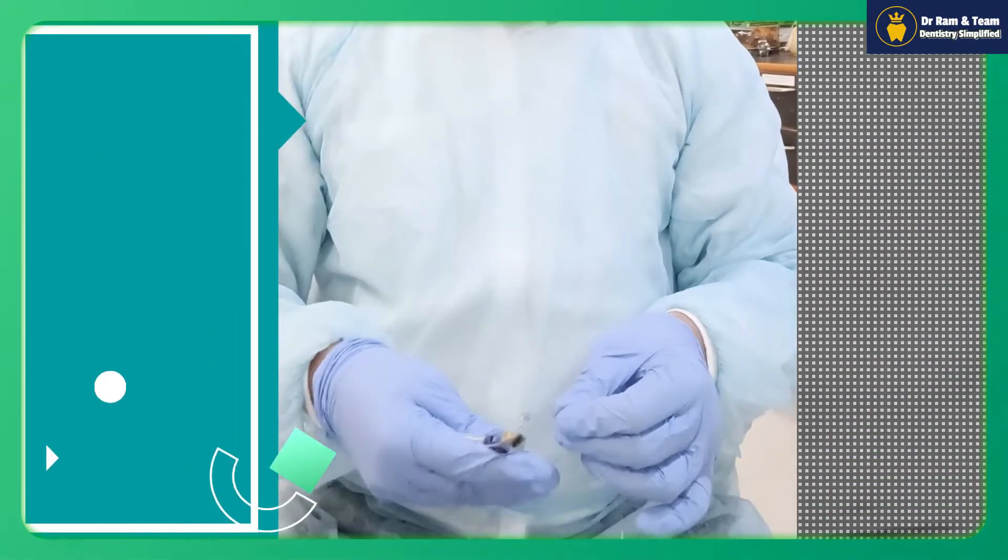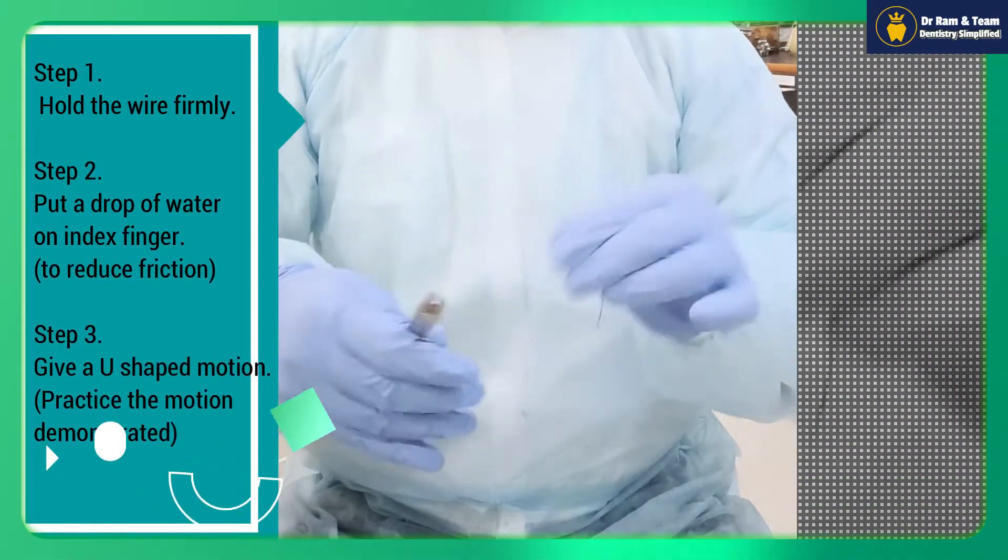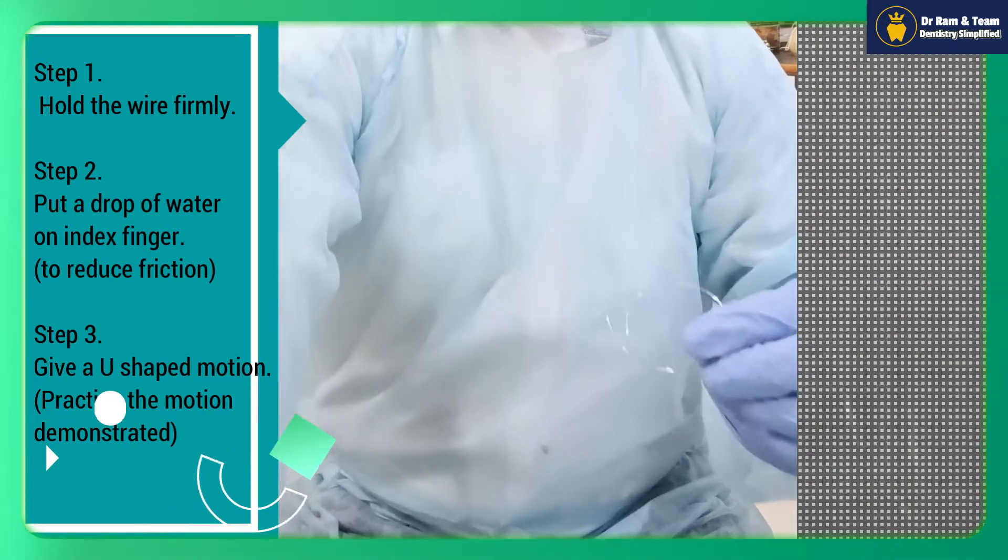Cut the appropriate length of wire as per the arch length and hold it firmly with your hand. From the other hand, give a U-shaped motion, then from the other side give another U-shaped motion. Your wire will get into a kind of U-shape.